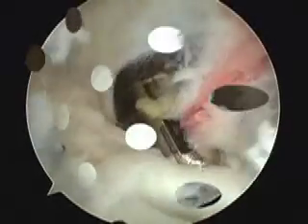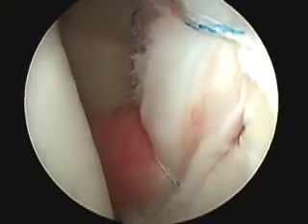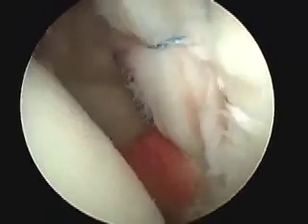Here we see the final construct. As we internally and externally rotate the shoulder, we can see how stable the biceps is with the intraarticular tenodesis in the lesser tuberosity. Here we can also see the final construct of the labrum repair with the Bankart and SLAP lesion very well fixed. At that moment the surgery was finished. Thank you.